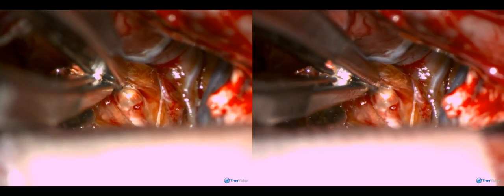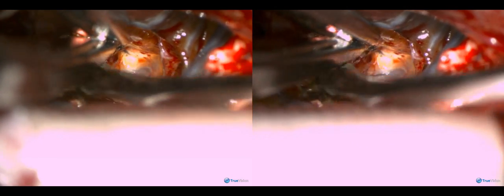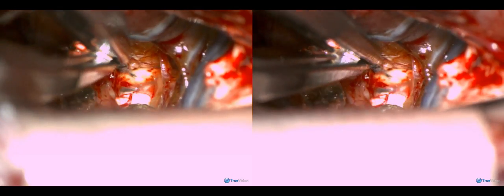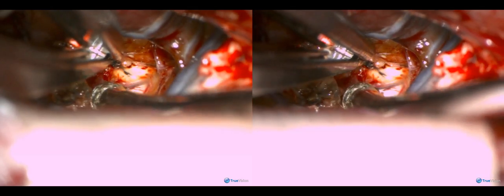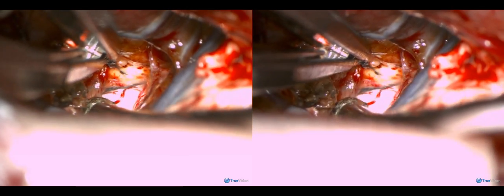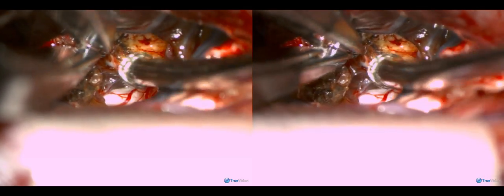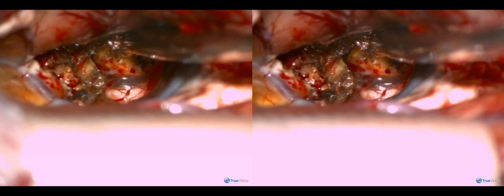We have now gone through the cavity all the way down to the carotid cistern on the contralateral side. You can see the perforators overlying the optic nerve and the surrounding arachnoid. A cottonoid is placed underneath the malformation so as to protect the underlying optic nerve.